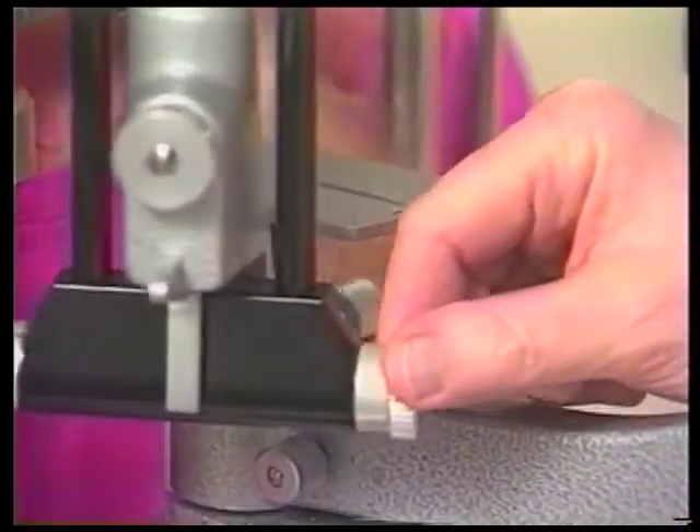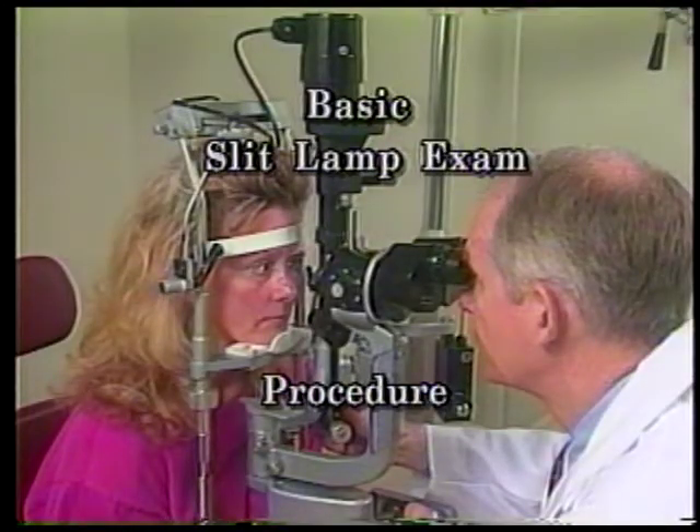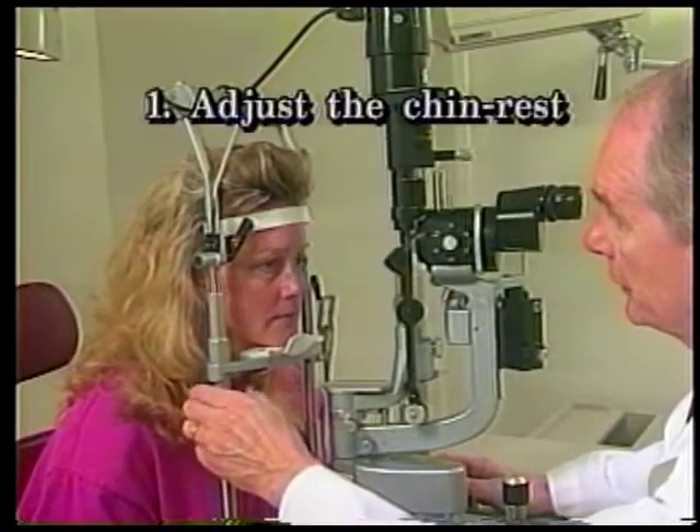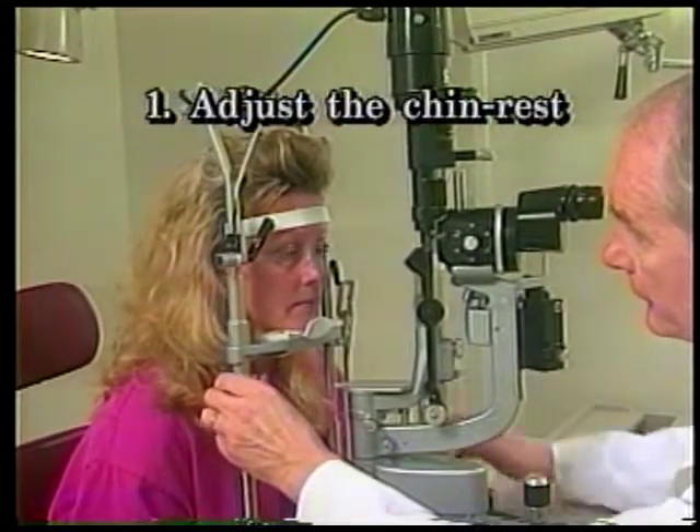The slit beam can pivot independently side to side through 180 degrees to permit viewing of any ocular structure from different angles, particularly helpful in depth localization. The basic slit lamp biomicroscopy exam procedure is as follows. One: adjust the headrest and height of the chin rest for the patient's maximum comfort and proper viewing level.